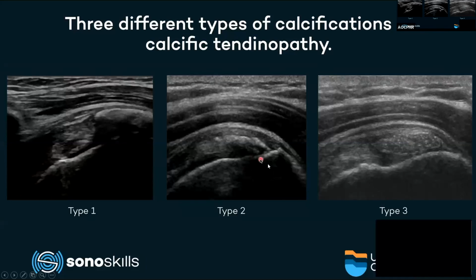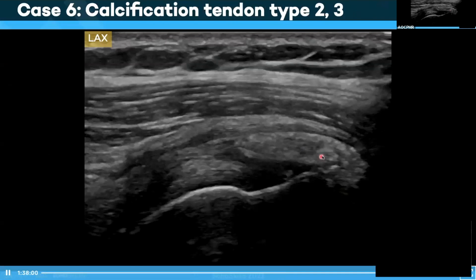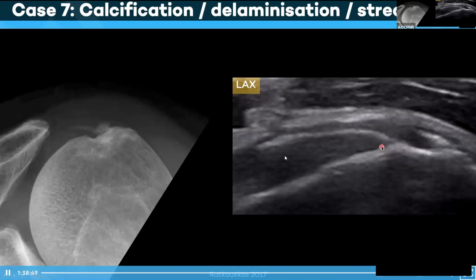Then it eventually goes through the resorptive phase, where it was hard, and at this point it has more of a really dense, frozen toothpaste kind of consistency to it, and eventually it becomes very hard. This is an example of very bad calcific tendinosis. This is not in a needle pattern. This is somebody who really shredded their tendon and didn't heal very well. So this is evidence of prior trauma, and usually underlying tears, bad tears. This is another example of an enthesophyte coming this way, right here. And this whole thing is calcium.